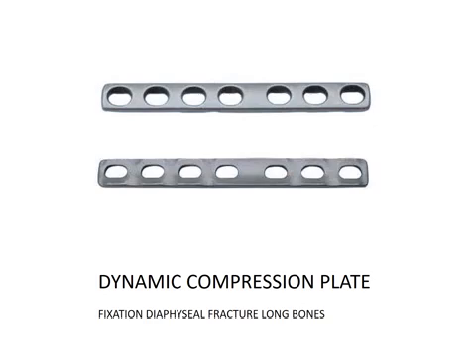The first surgery was dynamic compression plate for plating. Dynamic compression plate, as the name says, was a fixation method where a plate was put over the bone. The bone was exposed in total, and then you were putting screws to hold the plate. If you put a screw in the center of the holes, suppose it's a fracture site here, then this is called a neutral plate because this is simply holding on.